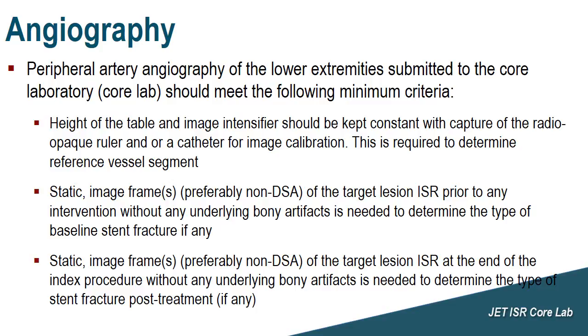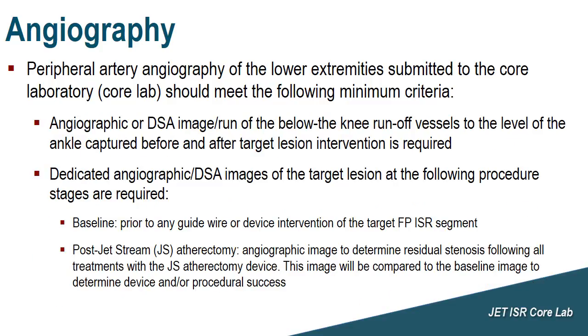Static image frames, again preferably non-DSA, of the lesion without bony artifacts are needed at the end of the treatment, again to see if there are any new stent fractures after the ISR segment is treated with the jet atherectomy device. Angiographic or DSA image runs of below-the-knee vessels are needed, at least at the level of the ankle, before and after target lesion intervention. You can understand this is to identify if there is any distal embolization.